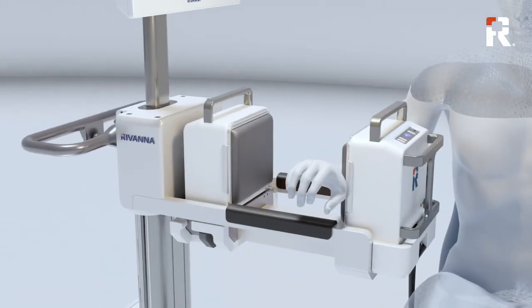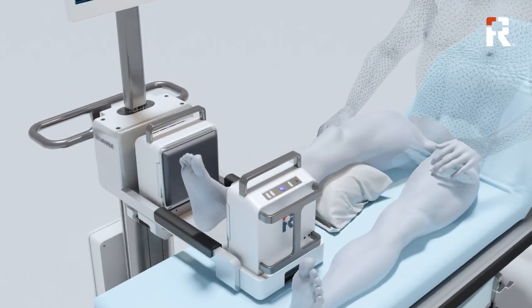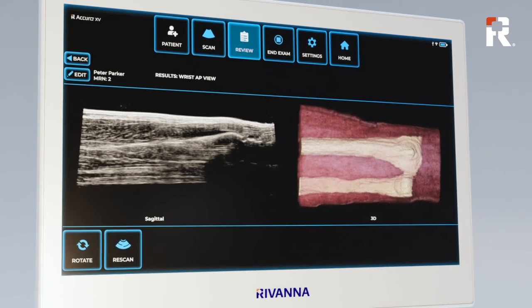The other tangible, I suppose, that we're looking at as far as primary outcomes is the level of pain. One of the concerns that's been raised, and it's a good concern, is because ultrasound does require contact with the patient anatomy, and we are looking at patients who have undergone a traumatic injury, and we're well over 200 patients. We are not seeing increased pain over what one would rate during the X-ray acquisition.